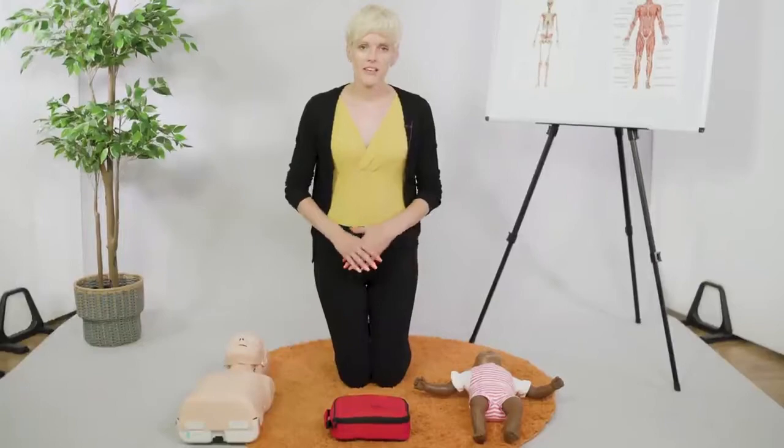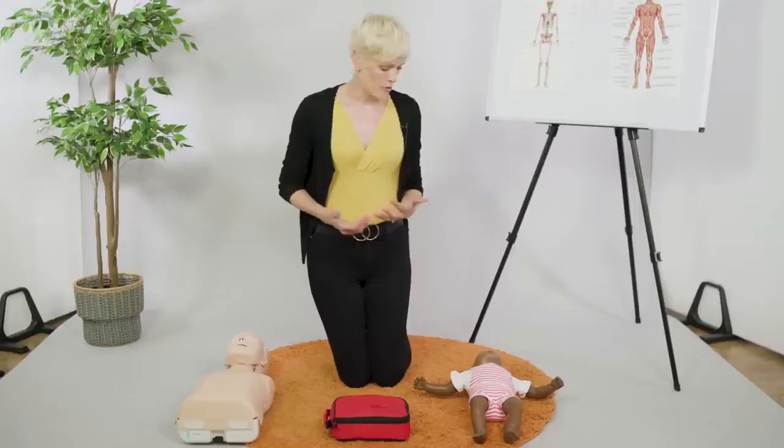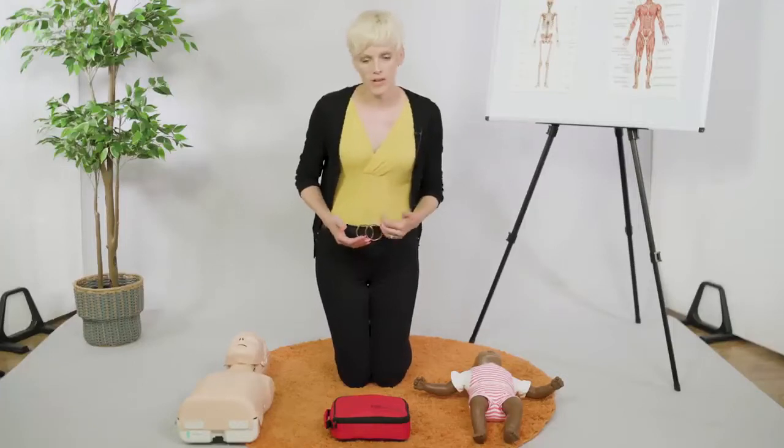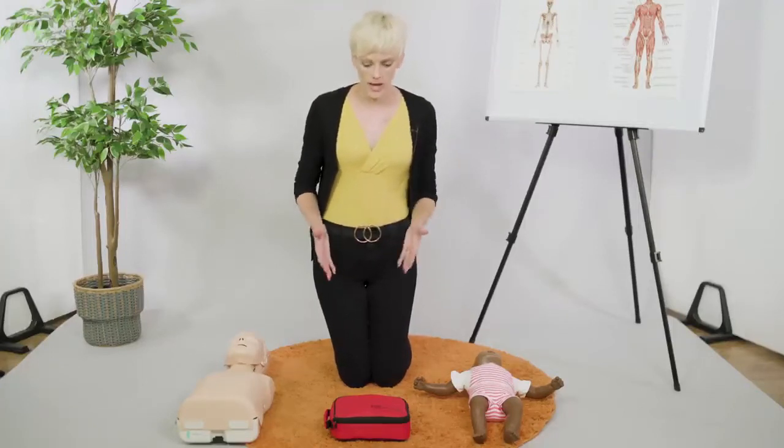Hopefully, if a baby or a child has stopped breathing and you've done your initial five rescue breaths along with CPR, that will hopefully bring them around. But in the event that it doesn't, we have asked for a defib.